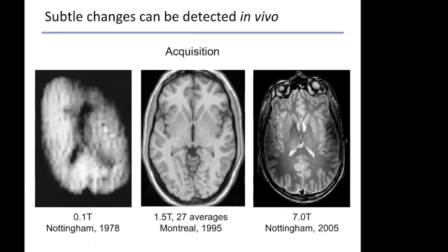Now, where you certainly benefit is in terms of spatial resolution and temporal resolution. If you really want to go into detail on specific structures, you could do that. But overall, the challenge is that there aren't a lot of 7T centers in the world yet. Still, there's a handful in Canada. The first one was at Robarts in London. We're now, I believe, only the second one for human.